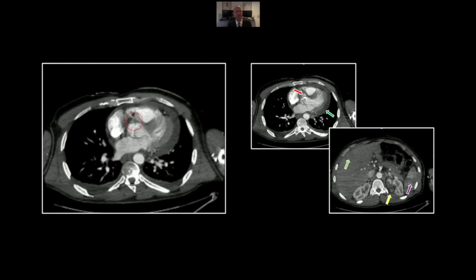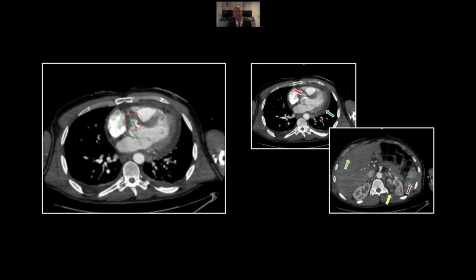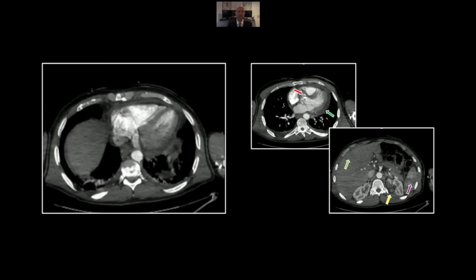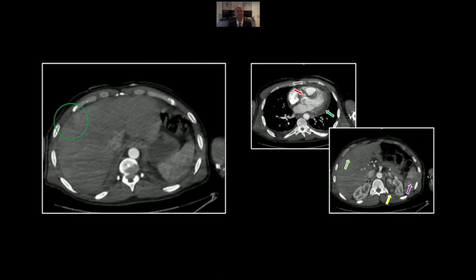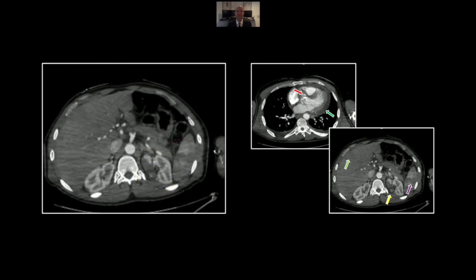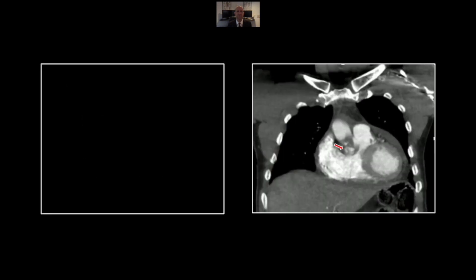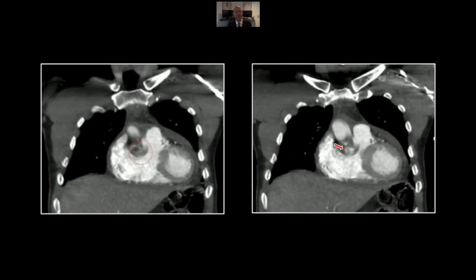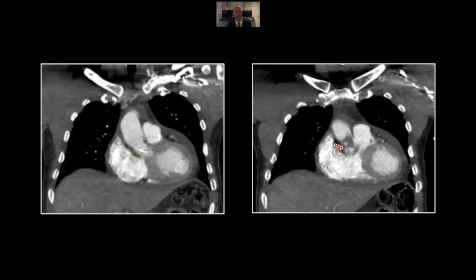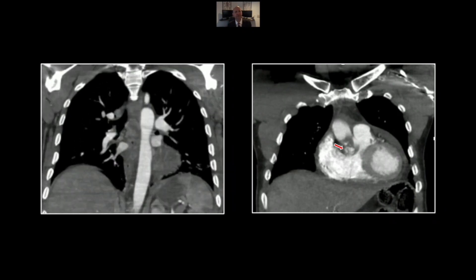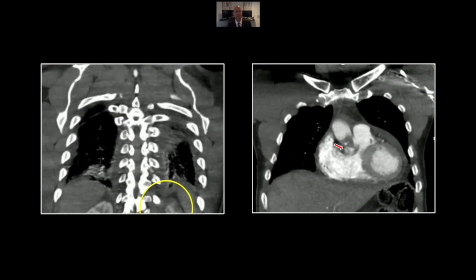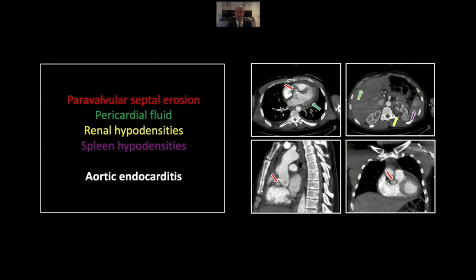Here again is the paravalvular collection of contrast denoting a ring abscess. And in the abdomen you'll see the infarcts of the liver, the kidneys, and the spleen. On the coronal coming from the front, there is the erosion and ring abscess right adjacent to the aortic valve. And in the abdomen, the infarcts of the kidneys are clearly visible. So that is a case of aortic endocarditis with ring abscess and distal embolization.